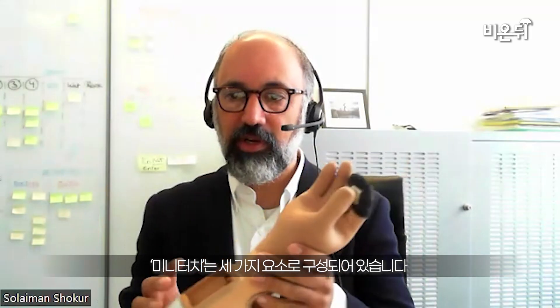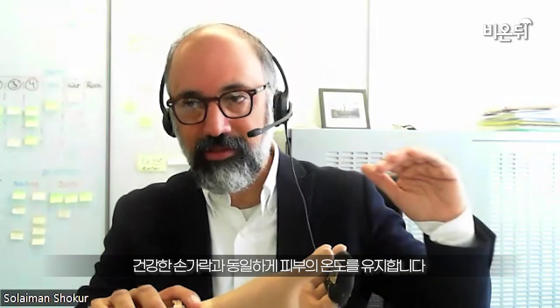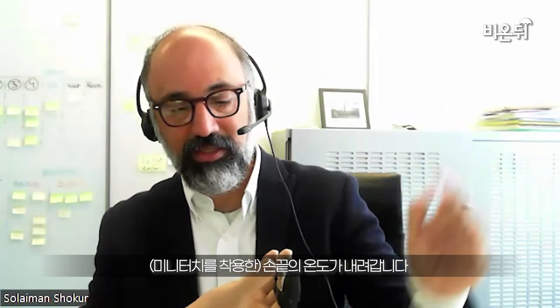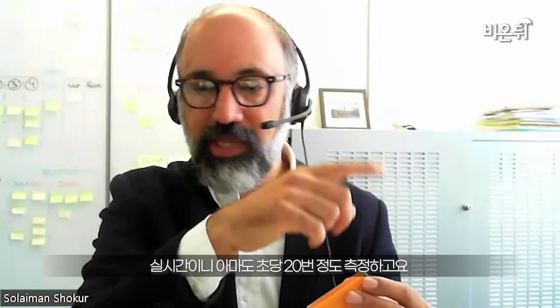So how we do that is our MiniTouch has three elements. This little sensor that we integrate here into the fingertip of the prosthesis — this sensor not only measures the temperature of the objects that this hand will be in contact with, but also maintains baseline skin temperature. This sensor will maintain 32 degrees when you're in contact with nothing, and when you touch something the temperature might decrease. If I touch a piece of metal, for example, it will decrease the same way that the temperature of my fingertip decreases when I touch a metallic object. Then this sensor goes to this controller, and this controller will simply measure the temperature in real time — about 20 times per second — and convey the temperature to this Peltier element, which will be in contact with the skin on the residual arm.